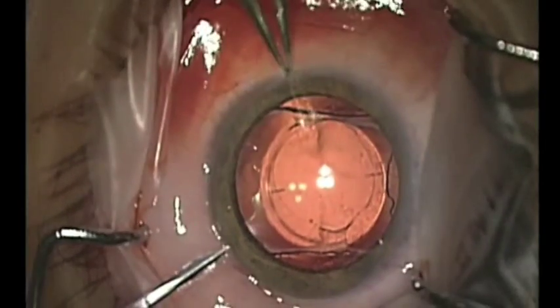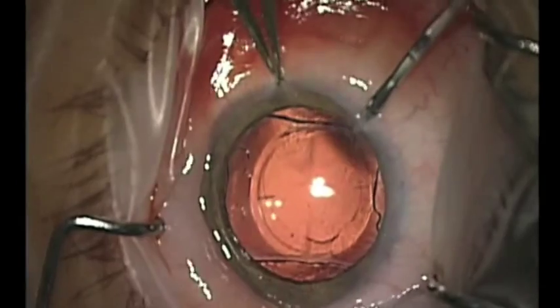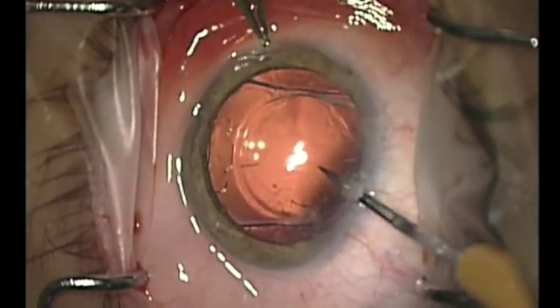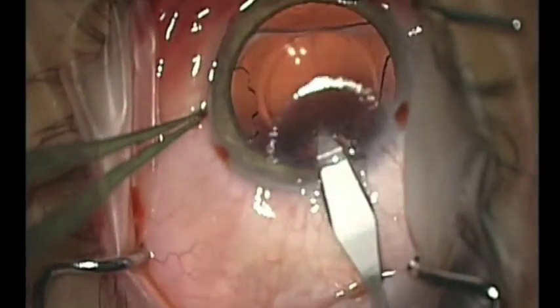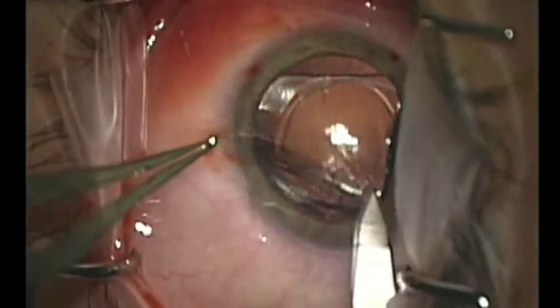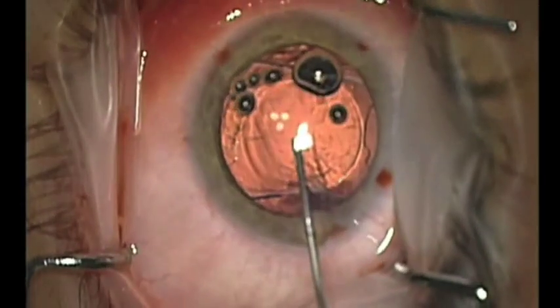First of all, several paracenteses are fashioned at various locations in order to allow accessibility of the lens inside the capsular bag. The main incision is fashioned in three steps and is then enlarged to over three millimeters to facilitate eventual explantation. Soft shell technique is used with a dispersive and then a cohesive viscoelastic.